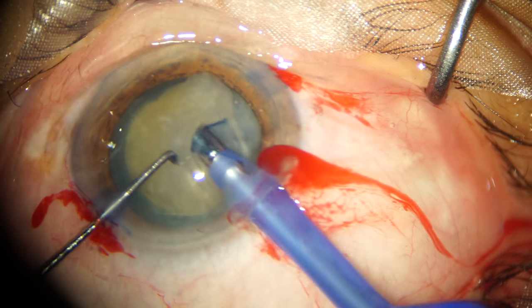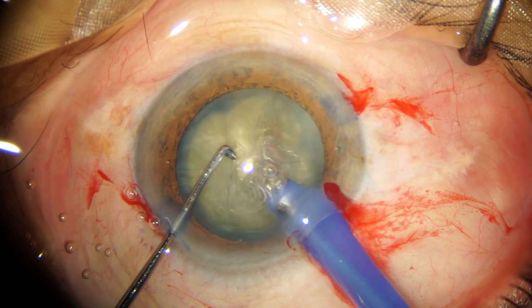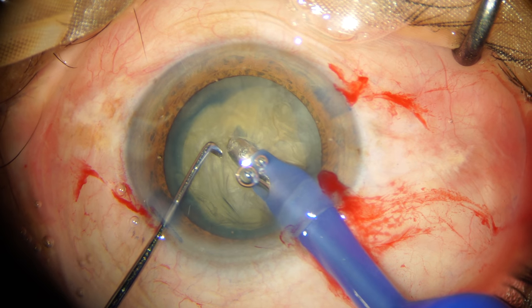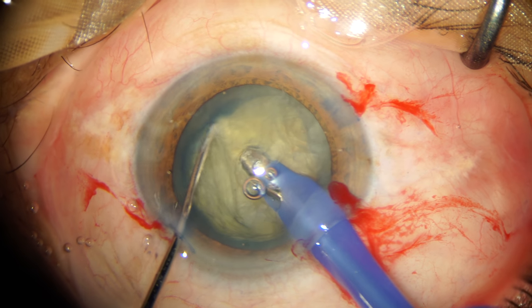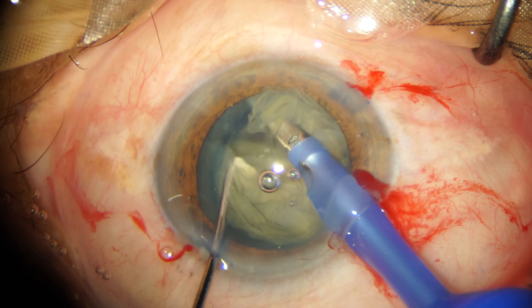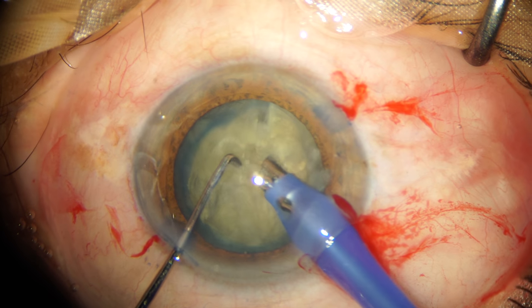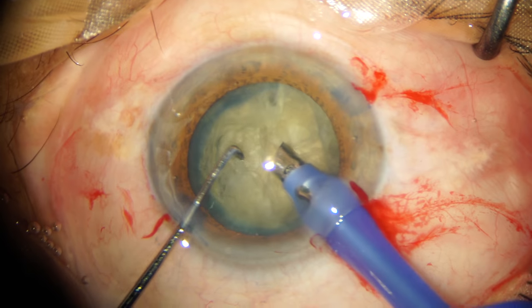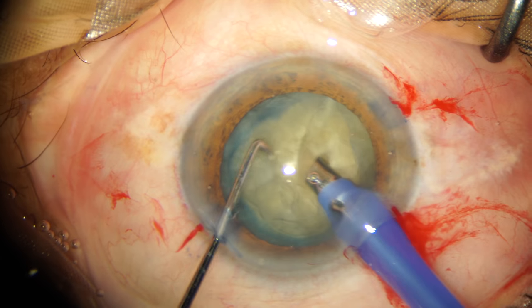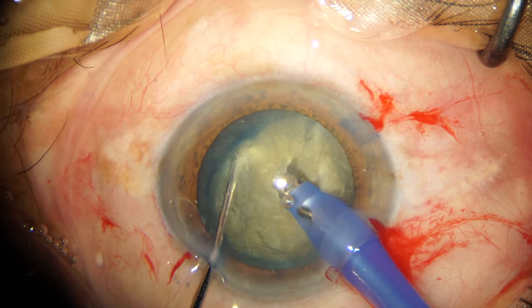Now we proceed with phaco emulsification. My preferred technique in a grade 4 to grade 5 nucleus is a direct chop. As you can see, I have impaled my phaco tip into the nucleus and I'm using my chopper to achieve the direct chop. With minor rotatory movements, I try to chop each hemi-nucleus into at least three pieces in a similar manner.